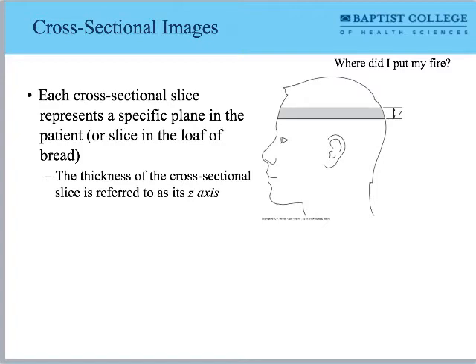So I will very seldom say z-axis. It's hard to say, it's weird. What I'll talk about is slices. And every time I'm saying slices, please just be thinking, he's saying something really smart and mathematical about the z-axis. Assume that I'm smarter than I look or something.